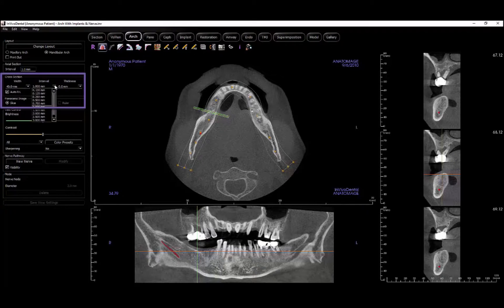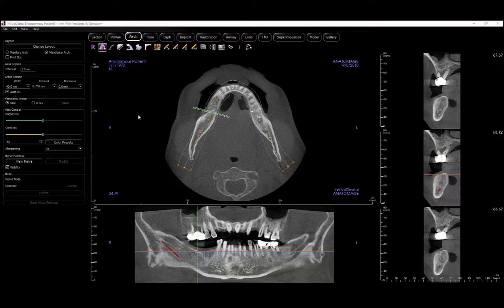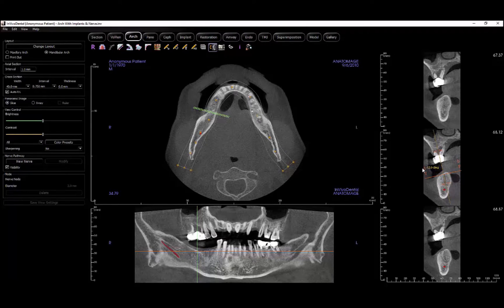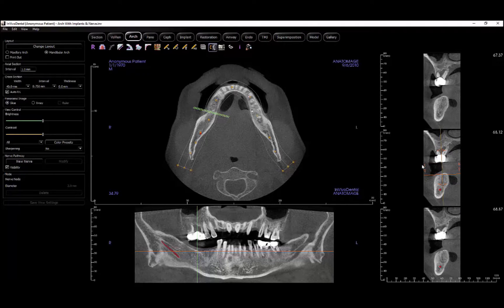There are various options to modify the parameters of your cross sections in the control panel. You can also temporarily reorient the cross section windows using the new rotate cross section tool in your toolbar. This tool allows you to rotate only the cross section windows without making any changes to patient orientation across the rest of the software. Click the tool to activate it, and then use the orange rotation arrows to reorient the cross sections. Click the tool again if you wish to return to the original orientation.